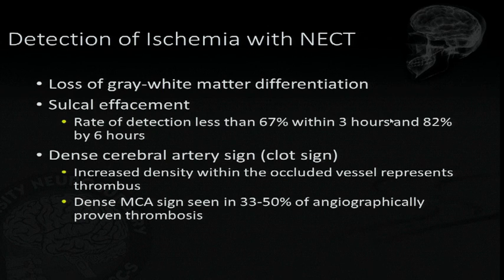In the first few hours, the findings are very, very subtle. And that dense MCA sign is about 30%. My experience is more about 30% than 50% of the MCAs. It doesn't mean it's not clotted.